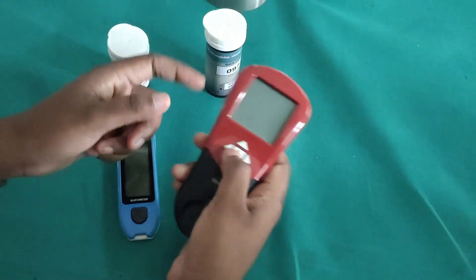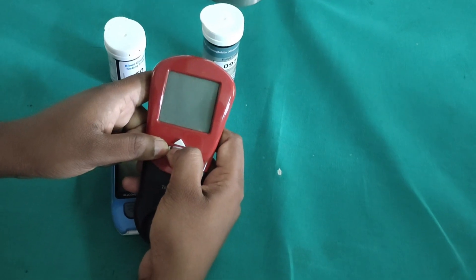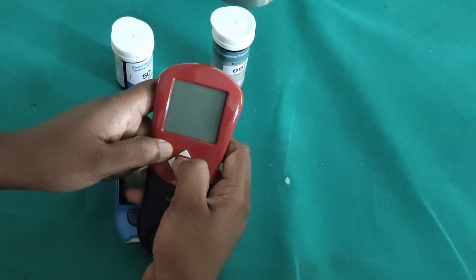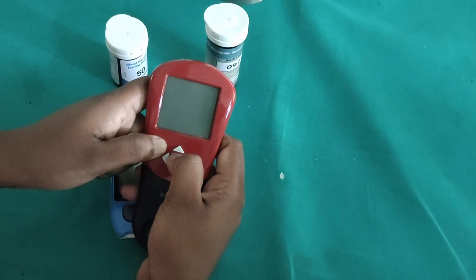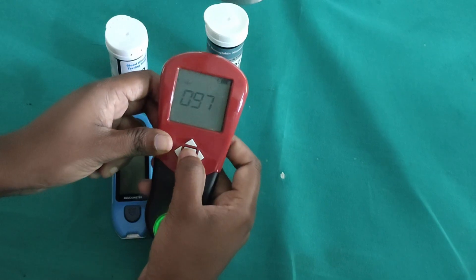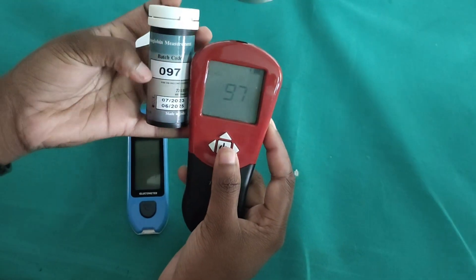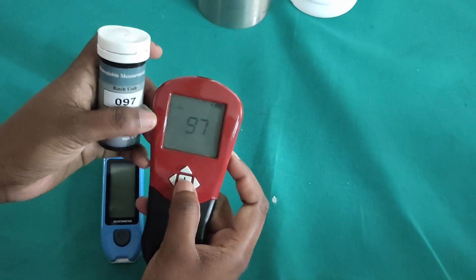First of all, we have to switch on the true HB meter. It will take 7 seconds to switch on, so we have to continuously press the power button. After that we will get a code, which should match the same code on the bottle — 097 — and the same code will be on the HB strips as well.